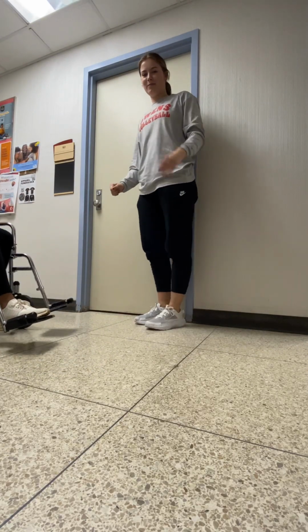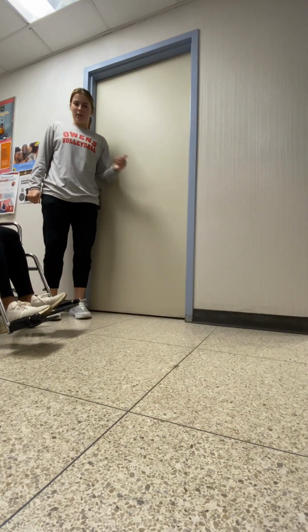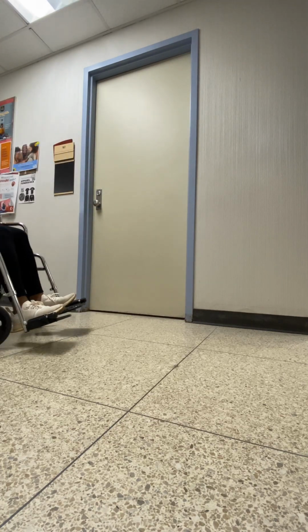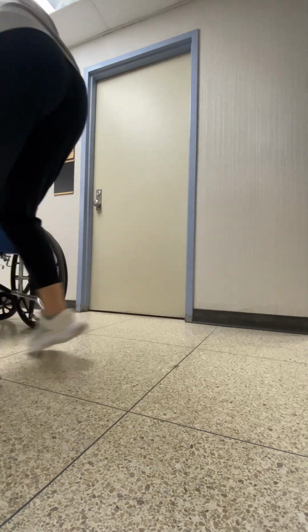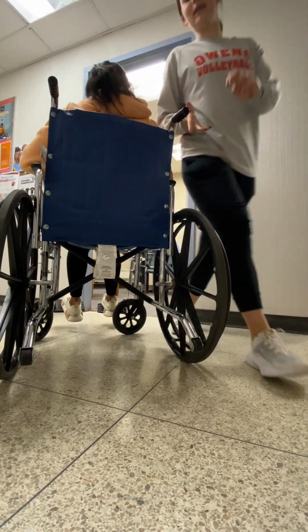So next we're going to be doing assisted with the door opening away from the patient. So you face the patient towards the edge of the door. Then you push the patient.